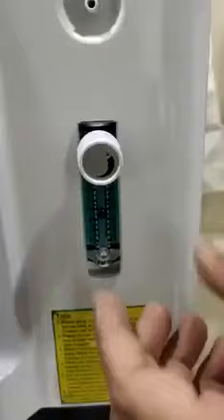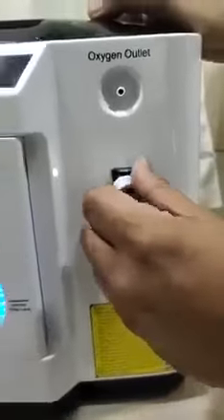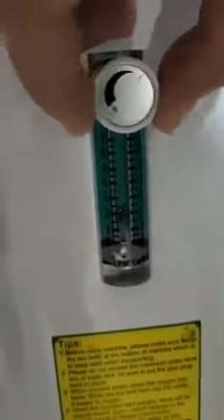This knob is to adjust the flow of oxygen — to increase and to decrease. If I am rotating it to reduce, it's going down — one liter per minute. Now if I increase it, it's coming up.